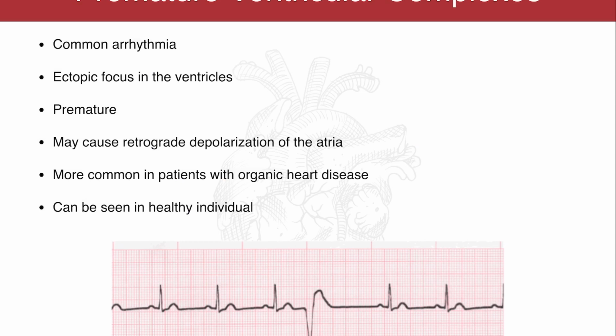The most common of the ventricular arrhythmias is what's called a premature ventricular complex. Some people call them a premature ventricular contraction. I'd like to call them PVCs for short. It's a super common arrhythmia. It's something that you will see in healthy individuals and those who are sick, and it is usually a daily part of our practice. In the emergency room, when we have patients on telemetry, we will almost always see some PVCs occur.